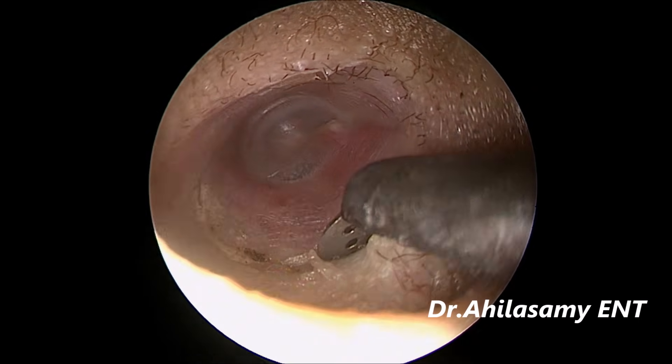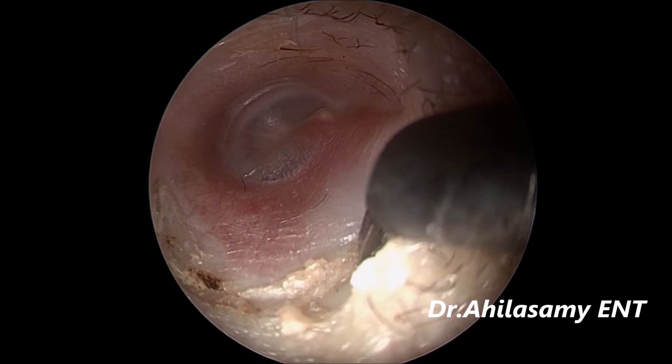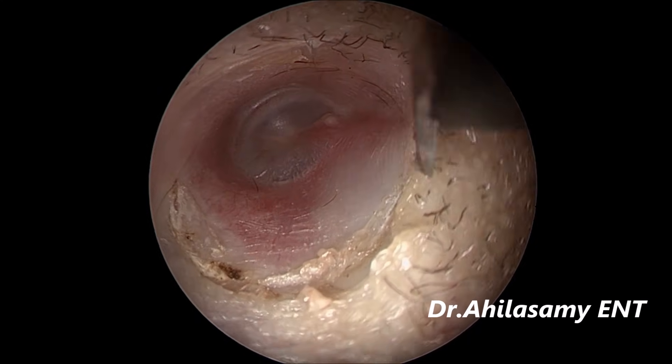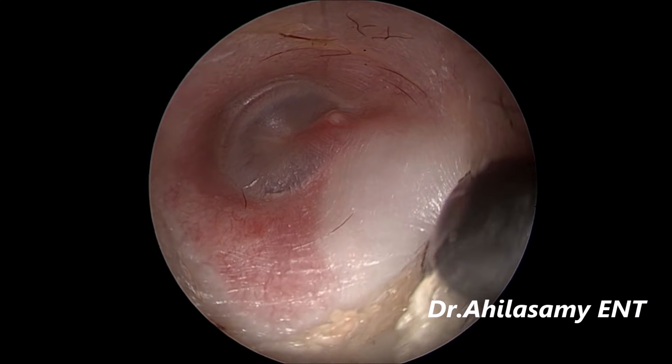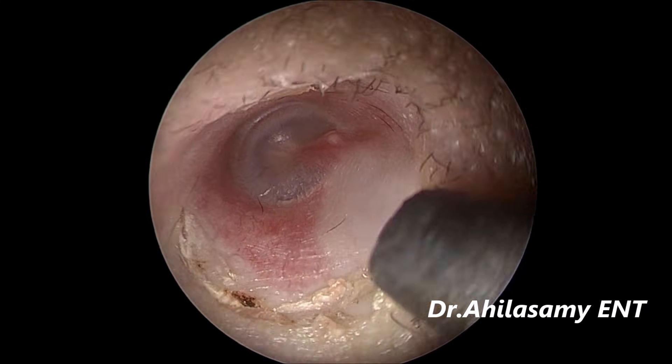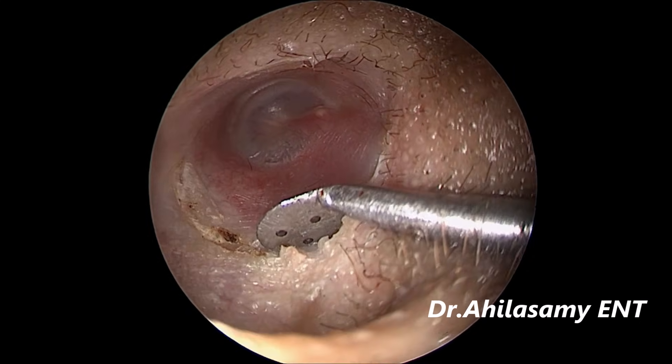Next I will be showing how the posterior bony overhang is being removed with the chisel. The rest of the steps I will be highly editing and showing in full. Of course, for completion I will also show a glimpse of all those things.